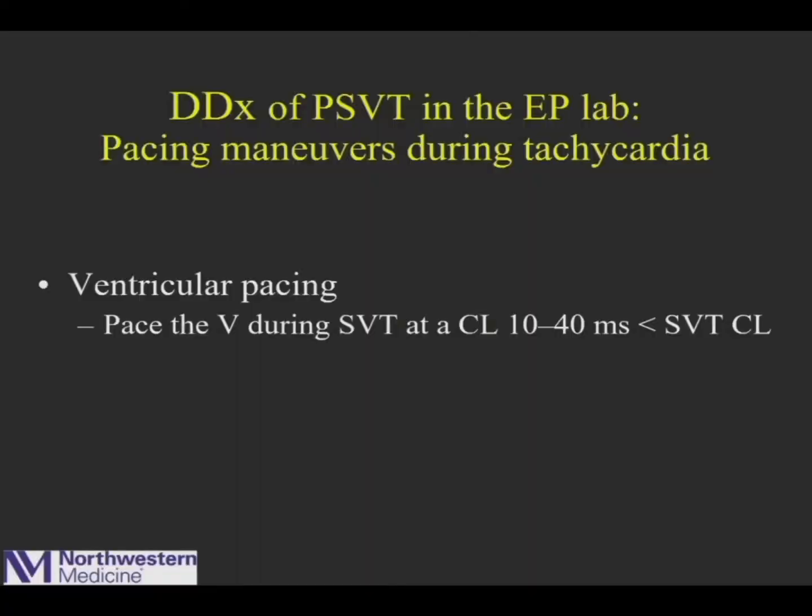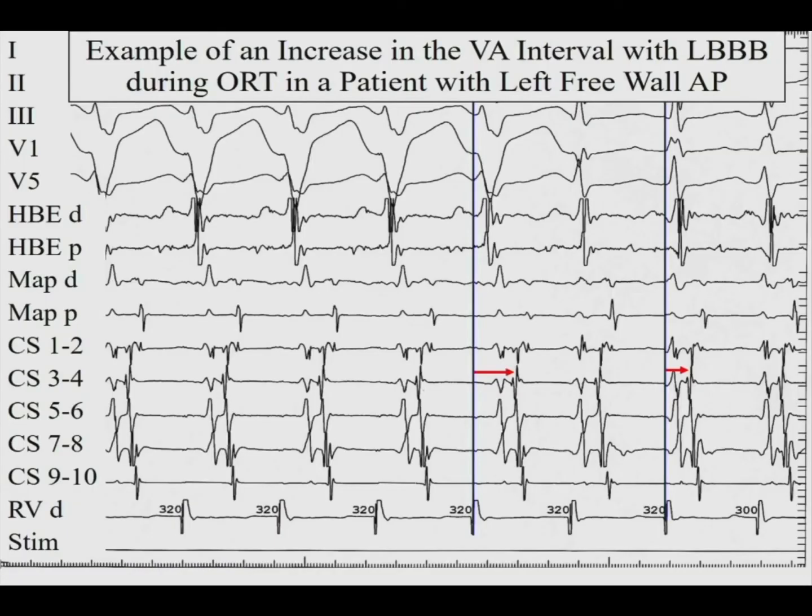But before I finish that, besides that there's no change in the tachycardia cycle, the local VA time doesn't change either, remember? It's from the onset of the QRS to the A. But the insertion site of the pathway, that doesn't care how long it took to get there. It's going to hit the V and then hit the A unchanged with a bundle branch block.